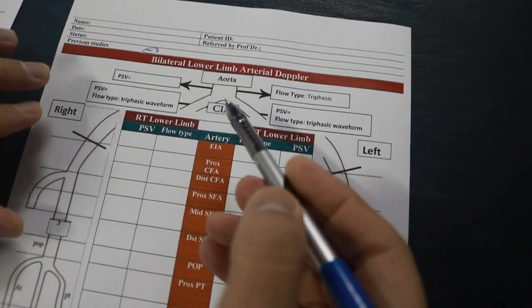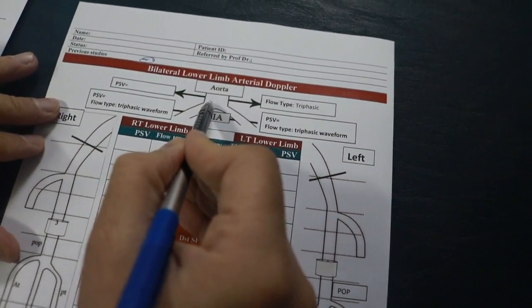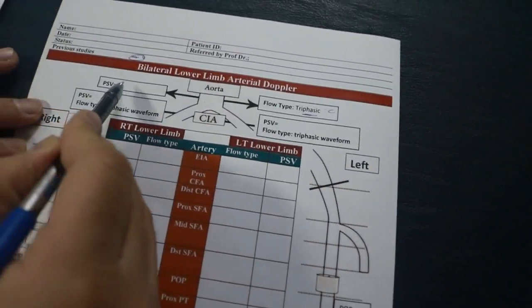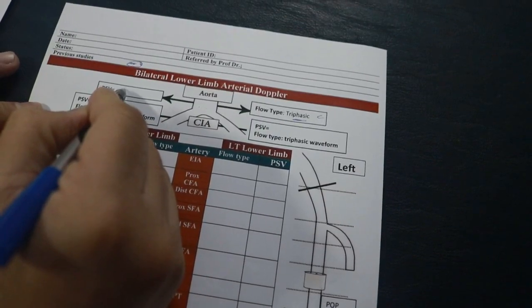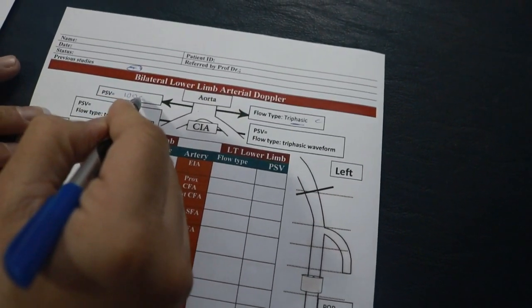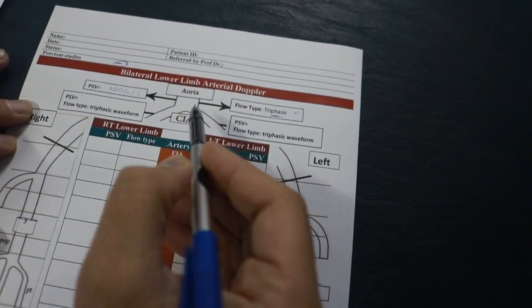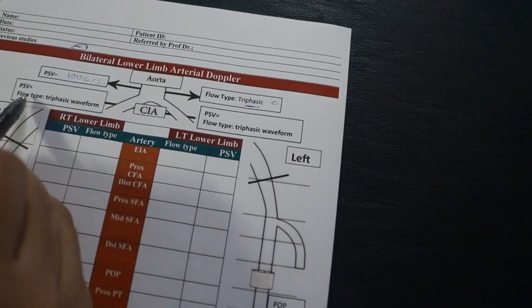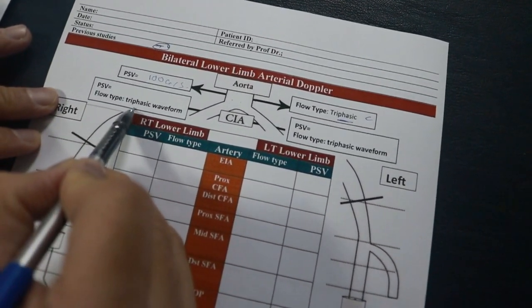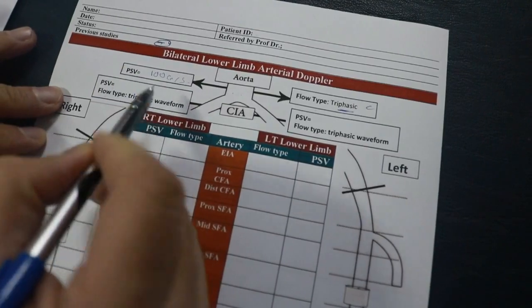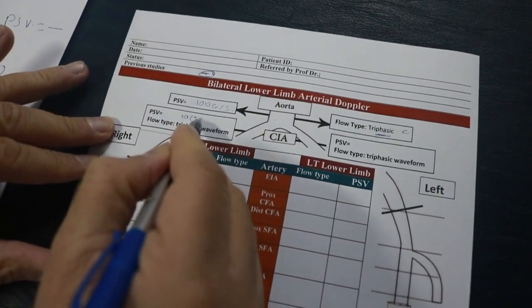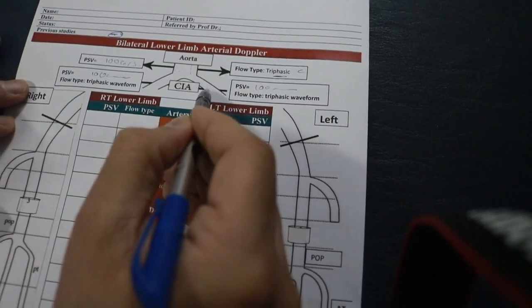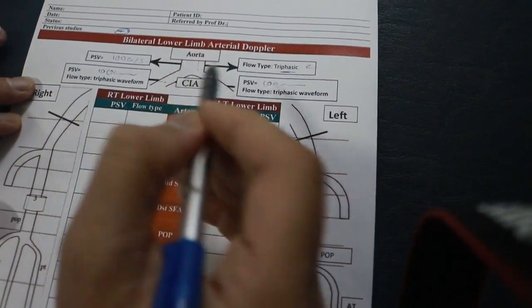Now what we did: aorta, type of flow was triphasic, peak systolic velocity was around 100 cm per second. Iliac vessels, type of flow was triphasic on the left and triphasic on the right. Peak systolic velocity around 100 cm, also around 100 cm. That means the aorta and the external iliac arteries was very good and normal.